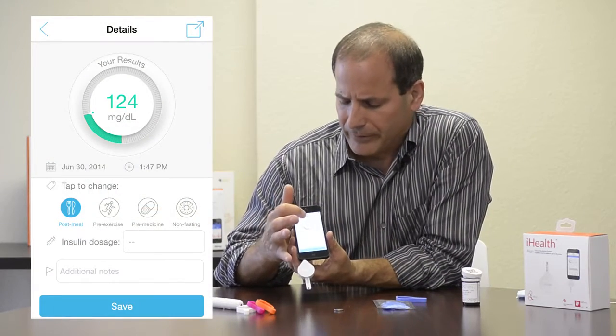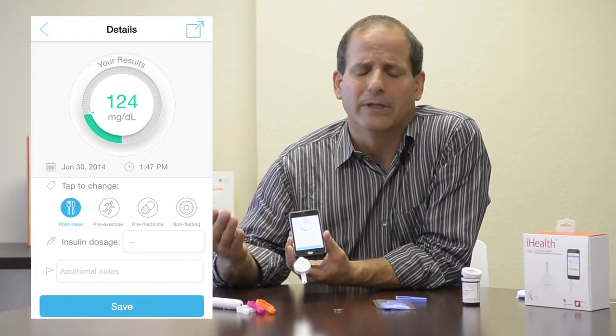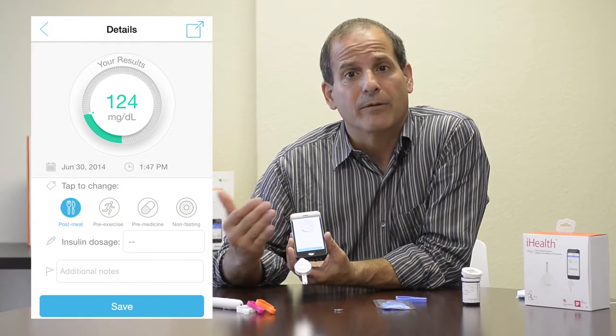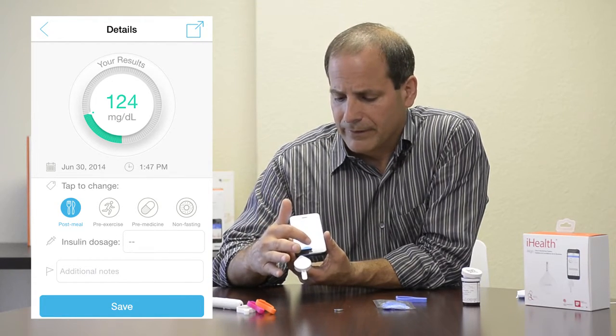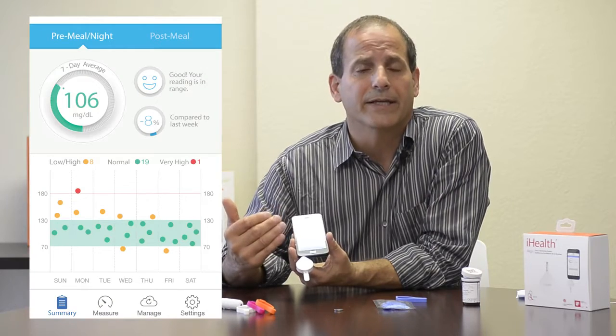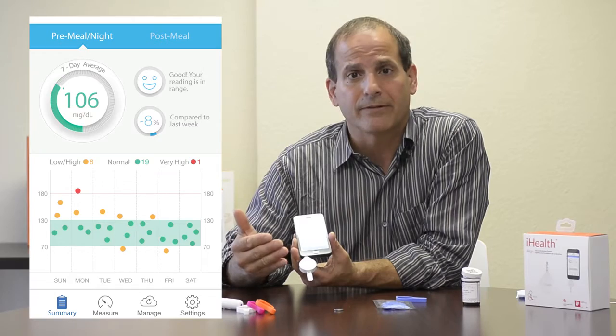Once you have your reading on the phone, you can tag it with additional information — including whether it's pre or post meal, whether you've taken insulin, whether it's been fasting, as well as additional notes. Then I just hit save and it's automatically loaded into my logbook, where I can look at trends over time as well as statistics.